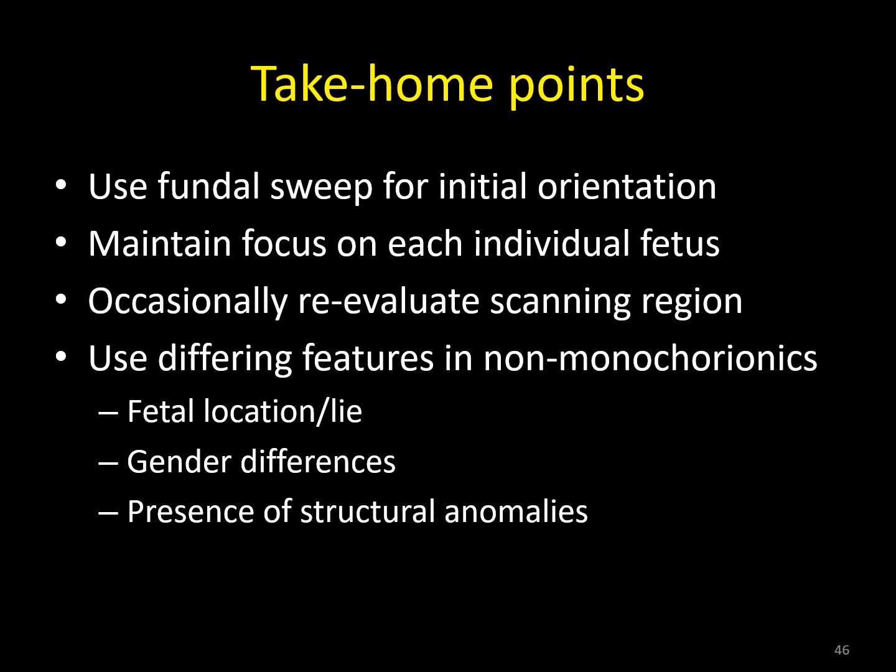And also remember that you can use differing features in non-monochorionics or multichorionic pregnancies. You can use differing fetal location and lie to identify. You can see the differences between the genders and ensure that you are scanning the correct fetus in that method. And also the presence of structural abnormalities in either of the fetuses can help you differentiate between fetuses.